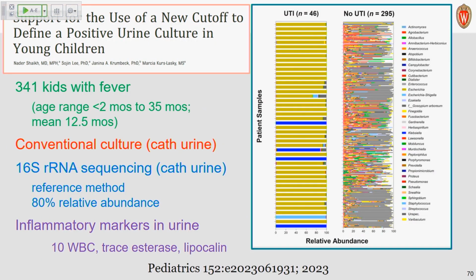All right, so Aaron Bowles led us to this paper. This is a recent publication in Pediatrics in which this group, I think it was United States, is advocating for potentially a lower cutoff for significant urine culture. I'll stand out of the way.